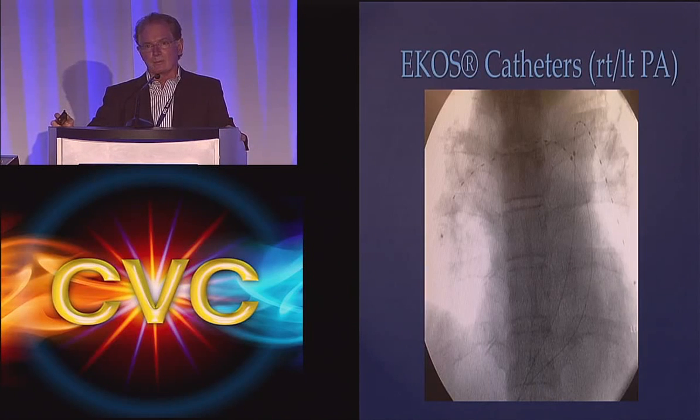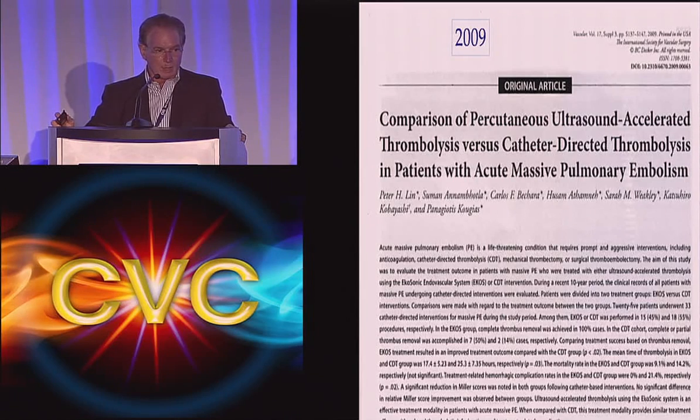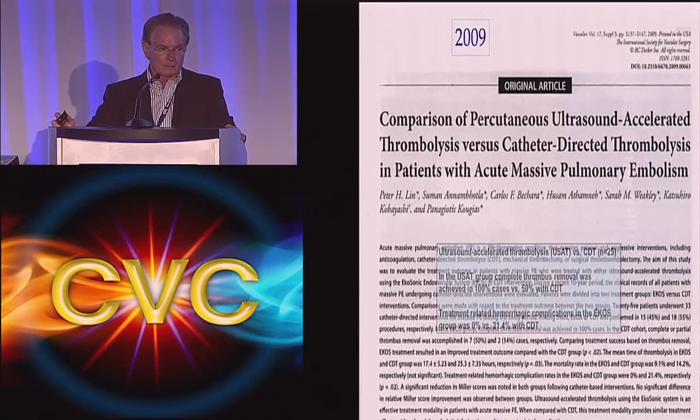And that's what, I don't know how many years it's been now, 30 years or more, was saying: if you want to get rid of clot, if you want to accelerate Mother Nature's way of getting rid of the clot, put the drug in the clot. Simple, and ultrasound helps. And you get this sort of thing quickly, surprisingly quickly. As Dr. Elder mentioned, in 3 hours they can convert from death's door to not. So you don't have to get rid of a lot of the clot.